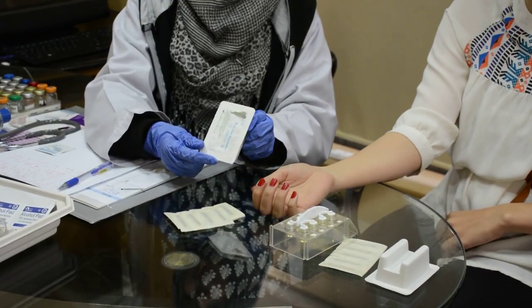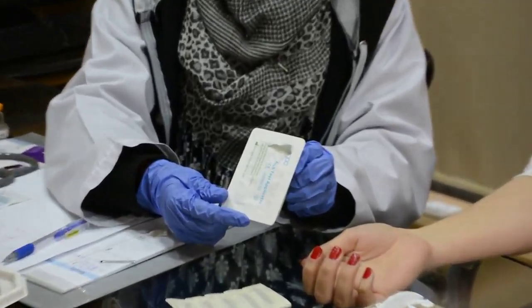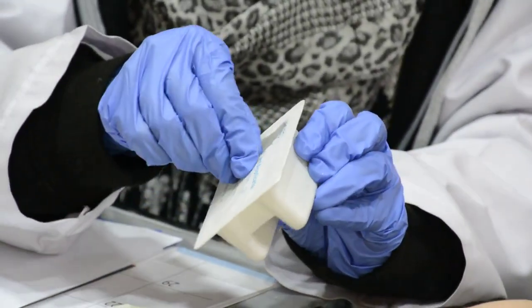For the first time in Pakistan, we have introduced the skin prick test with the latest painless allergy test applicator.